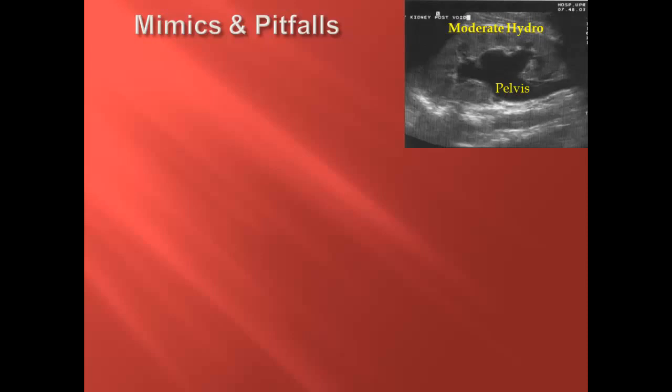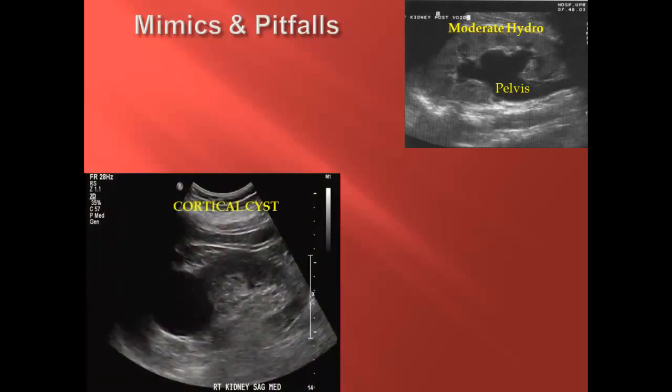Now let's quickly review some of the common mimics of hydronephrosis. Let's start with cortical cysts. They are dark, smooth-walled, and fluid-filled spherical structures, usually located in the cortex or the periphery of the kidney, far from the collecting system. They maintain their appearance in all planes of imaging and do not connect with the pelvis.